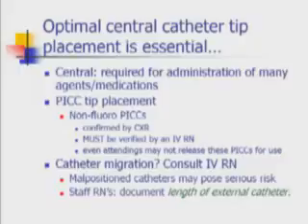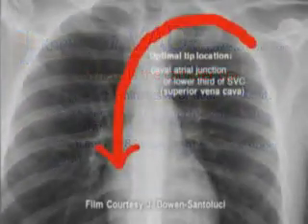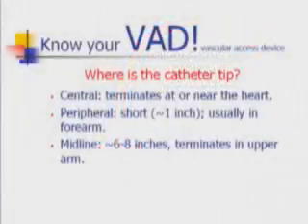Therefore, PICCs placed by IV therapy must be released for use only by an IV nurse, and significant changes in external catheter length must be discussed with an IV RN. At Fletcher Allen, evidence-based practice and policy dictates that optimal tip location for central lines, other than dialysis catheters, is at the junction of the lower SVC and the right atrium, otherwise known as the cavoatrial junction. Remember, IV therapy placed PICCs can only be released for use by an IV therapy nurse. Midlines are rarely used.